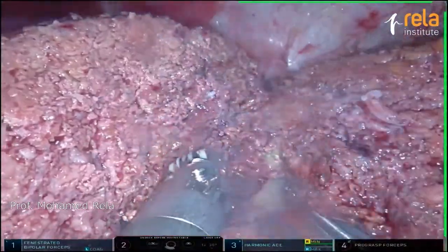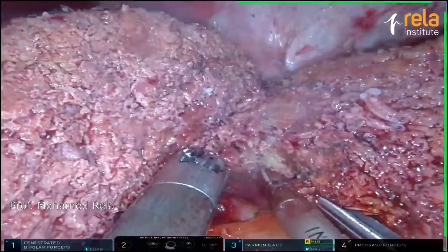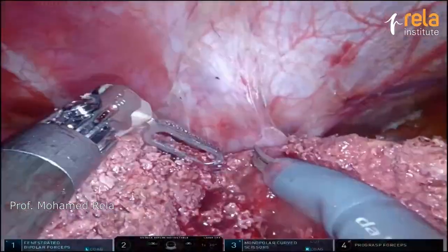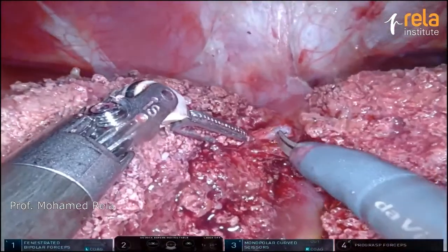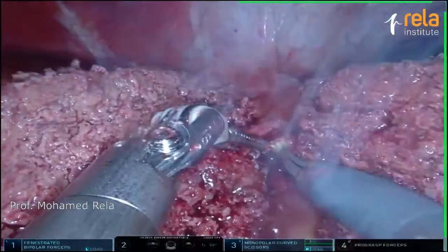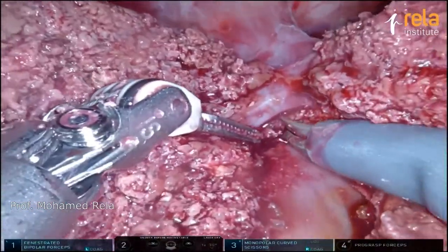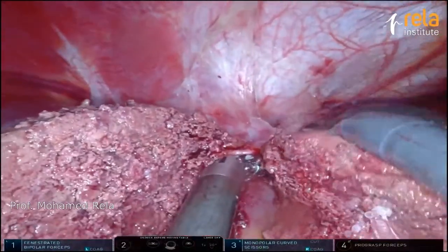The last bits of the transection — this is done purely robotically, no bedside surgeon doing anything. Towards the end, use the scissors to clear the left hepatic vein rather than using the harmonic. The left hepatic vein is isolated.